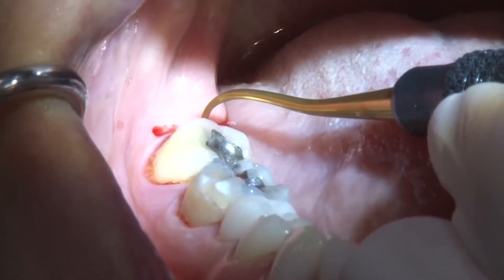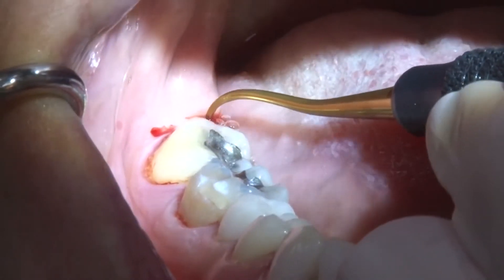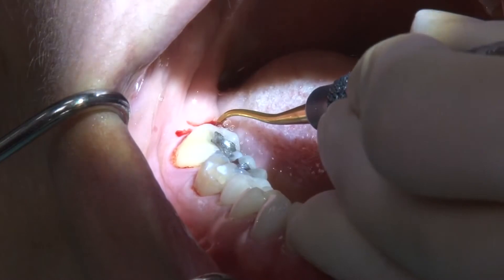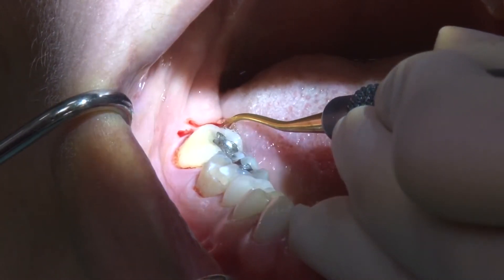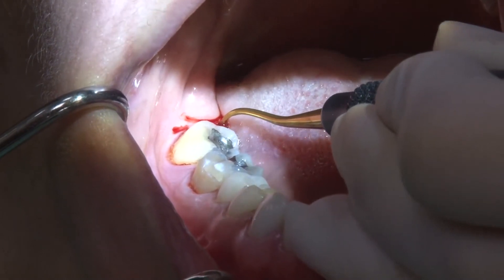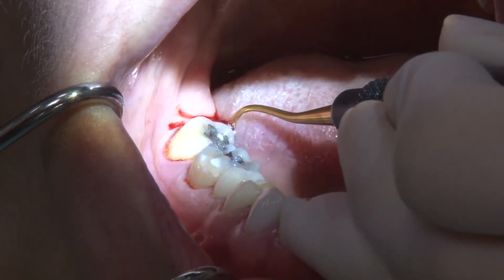Sharpening such a delicate working end would quickly compromise the intended shape. Sharpen Free XP technology allows the blade to maintain its original integrity and angulation throughout its lifespan, which is a great advantage to consistent patient treatment.